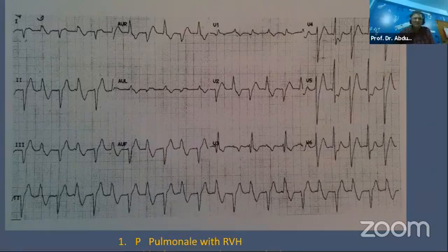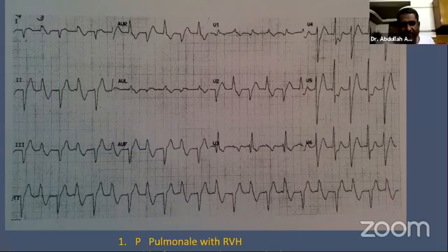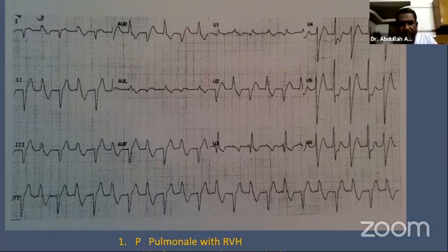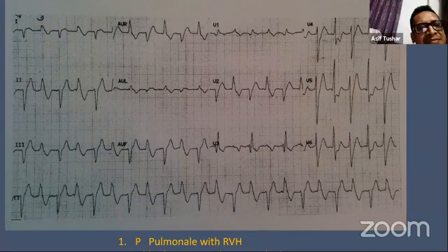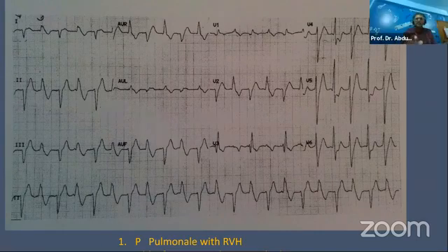Very correct. One possibility, if there were a pacing spike, then it could be a transplant heart with a pacing spike, a beautiful normal heart. A beautiful question asked by Atar bhai.